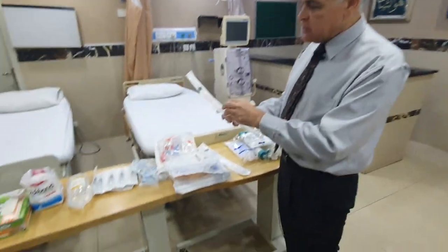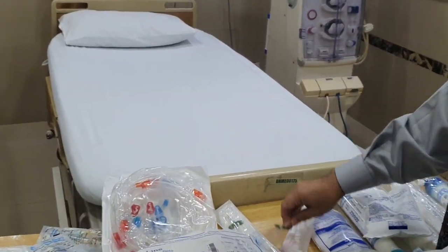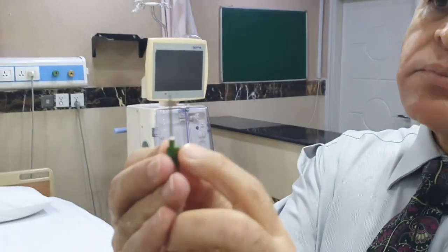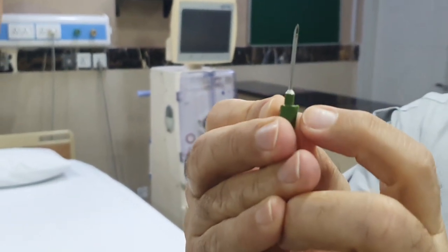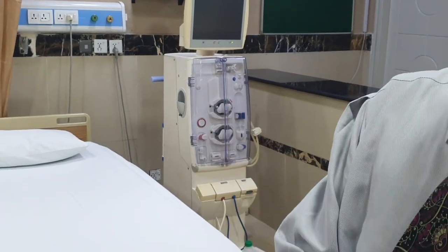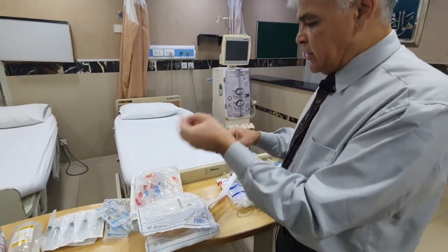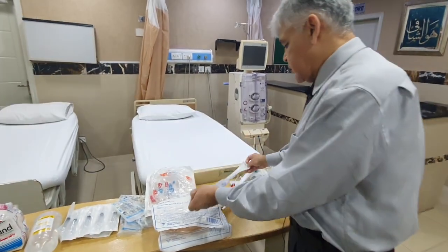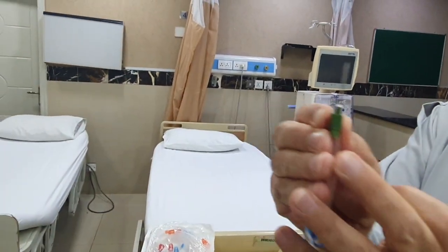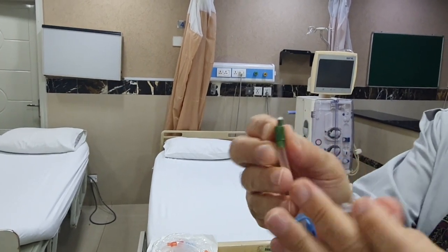But these needles, I'll just show you in a minute. I'm going to open up a needle here, and if you look closely at this particular needle, what you'll see is that there is a bore at the back. I hope you can see that. So there is one at the top, and there is a bore at the back. Now, this is in contrast to this particular one. This is the other one, the blue one. And here you won't see that bore at the back. In the first one, you saw the bore at the back. In the second one, you did not.